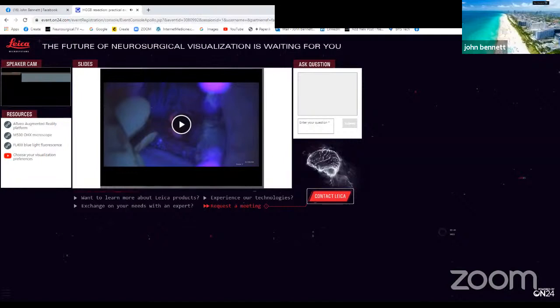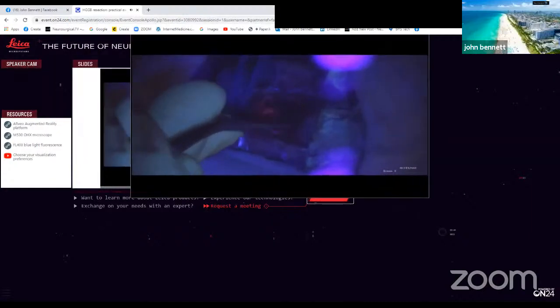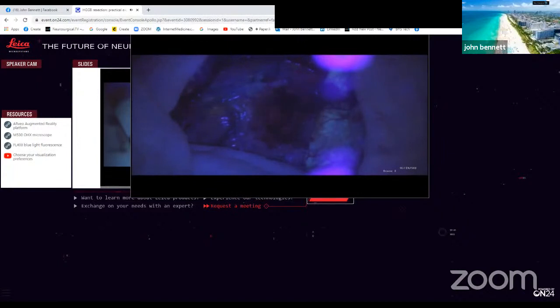This small video clip that I'm going to show you now shows how we use the 5-ALA during a fluorescence-assisted surgery. As you can see from the small video clip, the left side of the tumor cavity is brightly pink and fluorescent. And every time that you see blood filling the cavity, people tend to be afraid that the protoporphyrin 9 is adherent within the red blood cells, which it is not. So blood does not affect your fluorescence.